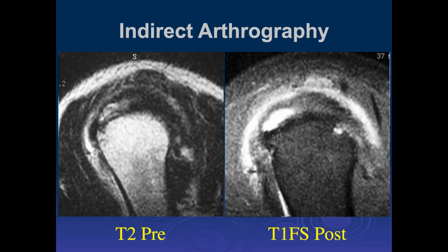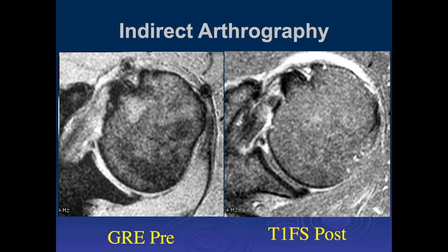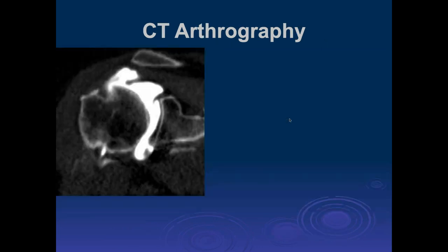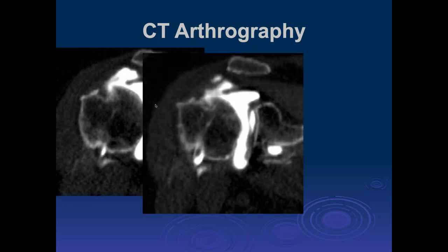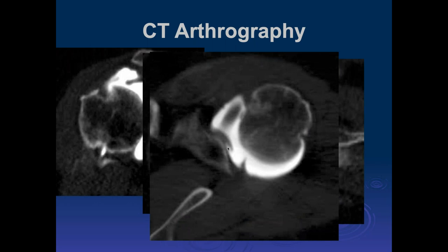Here's a case of indirect arthrography — you can get enhancement of soft tissues and even enhancement of tendinosis from tendinopathy with the IV injection. CT arthrography: if someone can't have MR, CT of the shoulder is very limited unless looking for bony detail, but you can do CT arthrography to see tears. Here's an example of the long head of the biceps tendon with CT arthrography showing a tear.